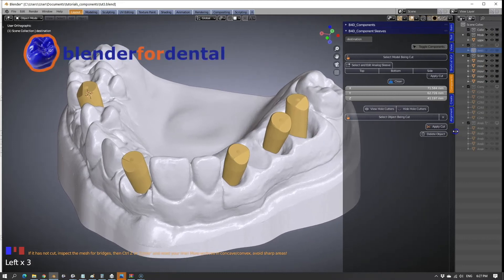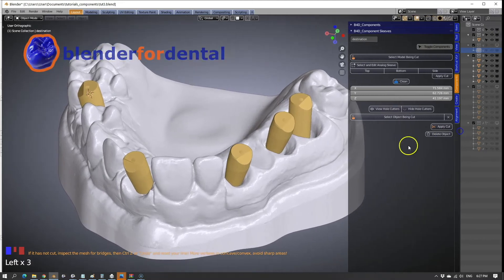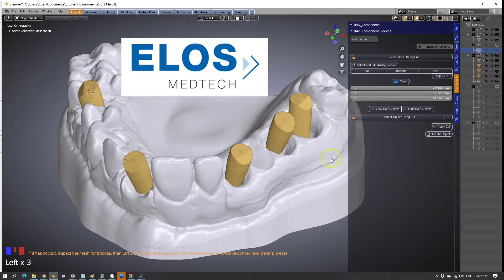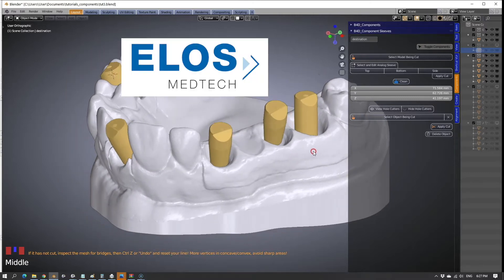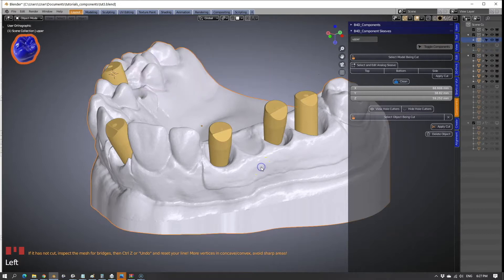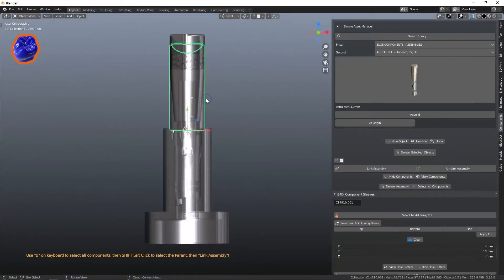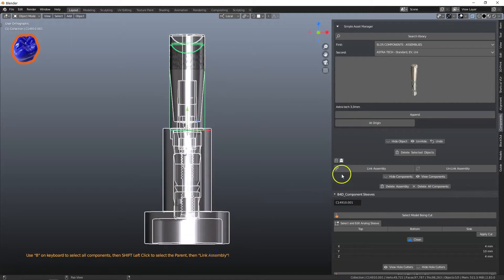Blender for Dental is powered by the open-source Blender software program. The component module now includes ELOS components for designing your 3D implant models. Implant components are already pre-assembled, which makes sorting of components easy.